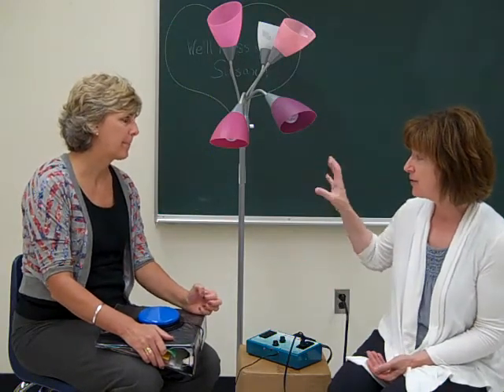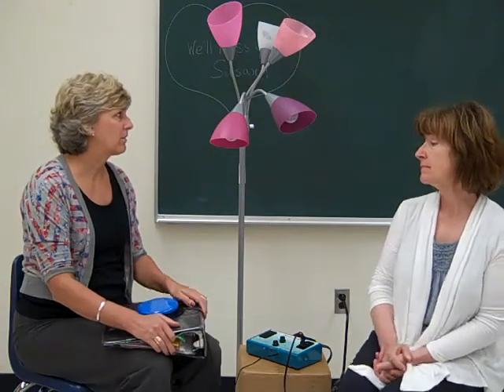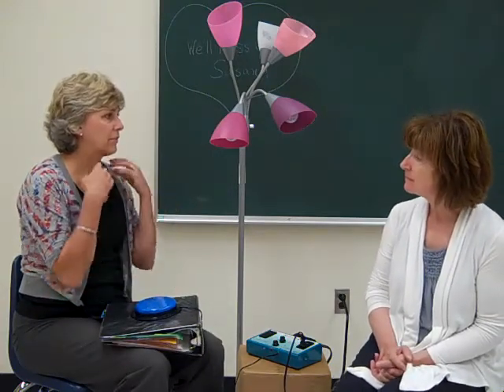How long would you say you spend doing this activity before she tires of it? I start off with other activities — the passive range of motion, the positioning, the sensory input, the weights that are already on there — maybe 15 minutes on that, and then I usually finish up with this. I would say I give her at least 12 minutes on the switch. Her signs of fatigue: she'll turn a little flushed, she starts to bear down on her hands, and usually biting with her mouth — that's when I know she's done. I usually come in between PE and snack time too, so she's a little bit more alert.